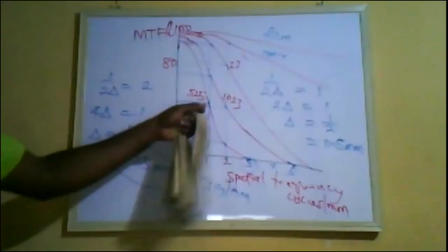And this spatial resolution: when you say that film has a better spatial resolution, and I understand it has a better spatial resolution compared to the image intensifier, maybe you can throw more light on it, with respect to this diagram. Yes. Okay.